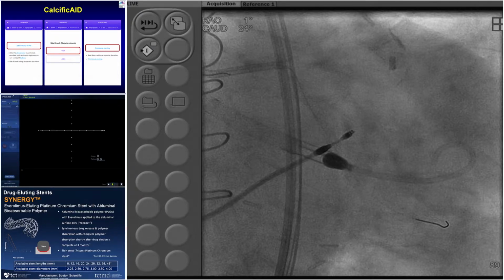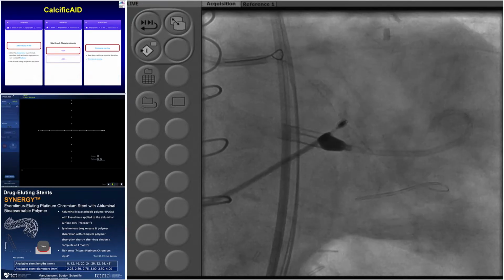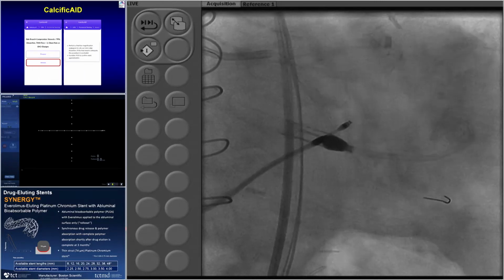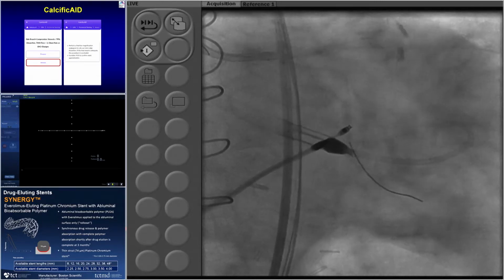Yeah, and you haven't post-dilated that distal stent yet, right? Not yet. Yeah, that we can do later, yes. Let's not forget to go back on the wire, go back on that. Okay, is room 1 ready? I'm sorry. No, but let's put this stent, and then you go to there, yeah.